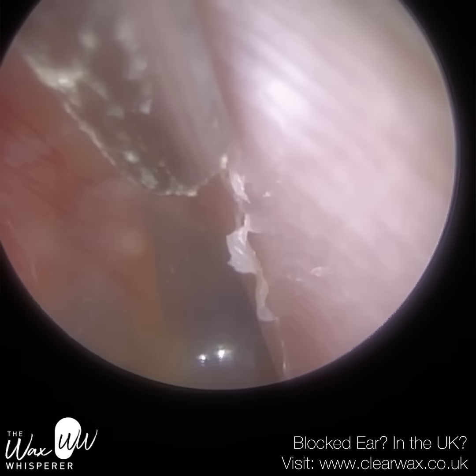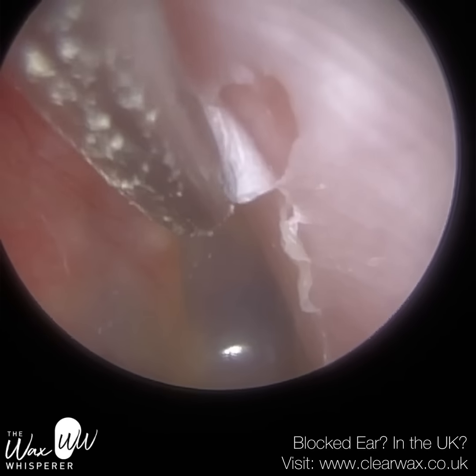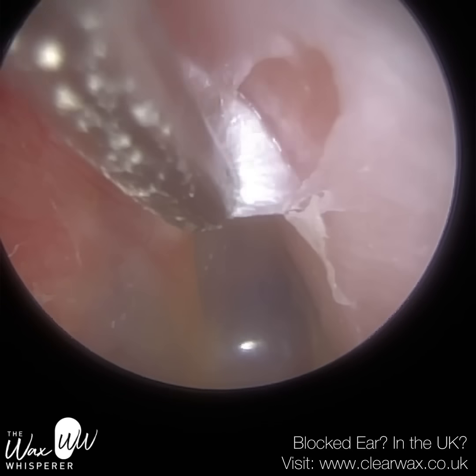So here, very gentle. I've switched the fine end in the opposite direction, so the angulation is going away now. So I've managed to get a piece here. There is some skin there still, but that's not going to come away. But I'm going to try and peel this away.